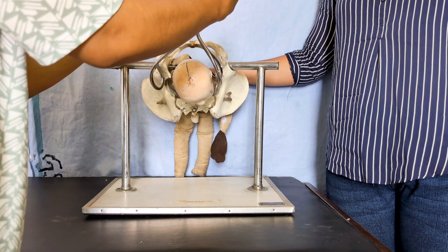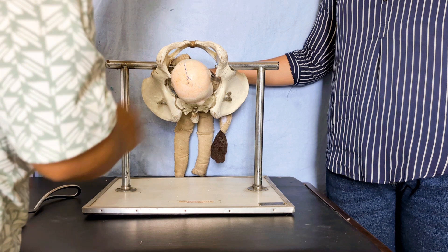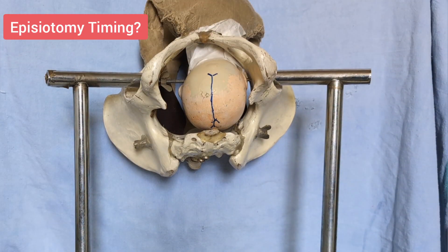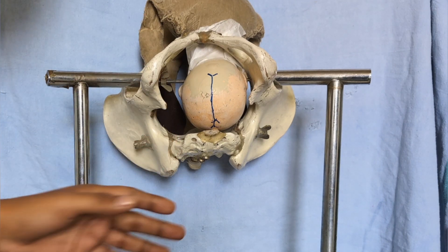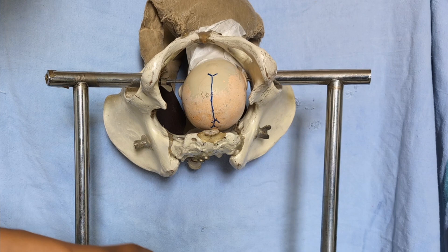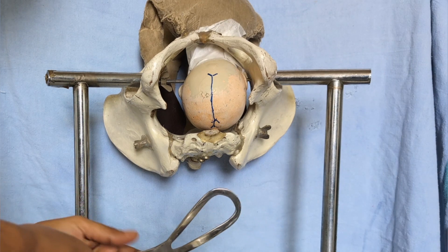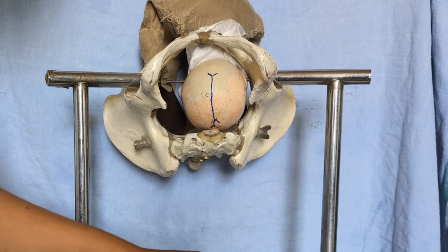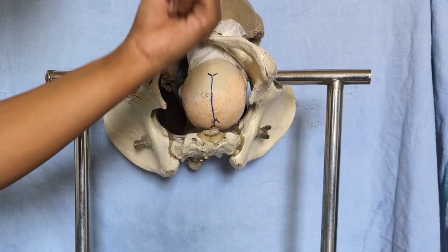After delivery of the fetal head, unlock the forceps, remove them, and deliver the shoulders and body as usual. Regarding episiotomy — it should be done on an individualized basis. If you feel the patient may need it, give episiotomy to prevent perineal tears.